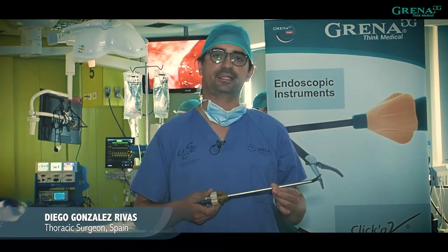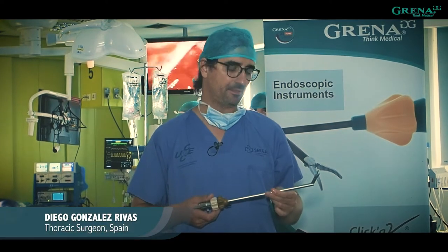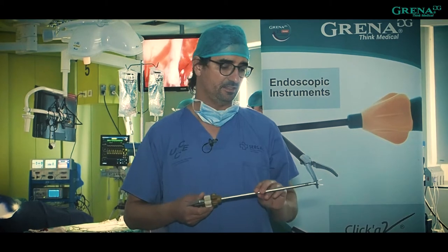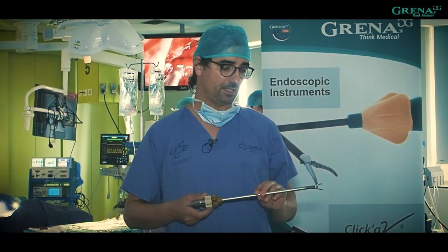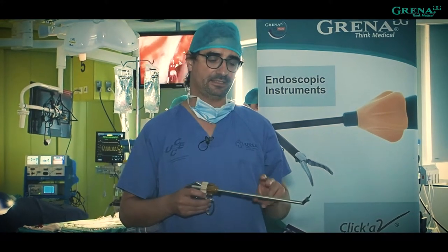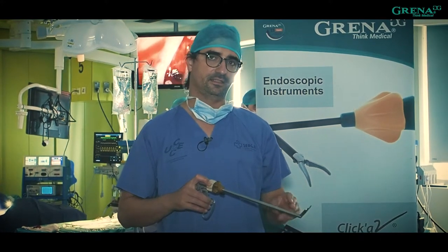This is the new applier of Grena clips for polymer vascular clips. It's a very important advance because you can use the applier straight, or if you want, you can use articulation. For uniportal VATS, this is especially important because sometimes you need to see the tip of the clip.